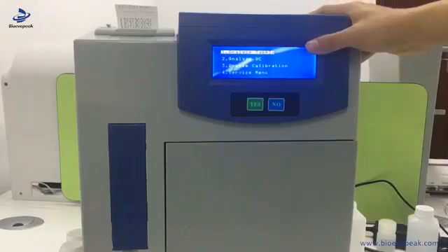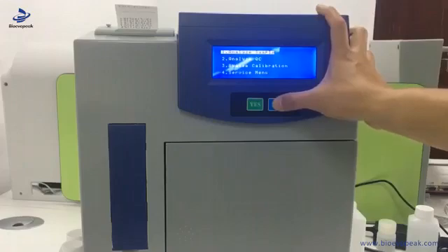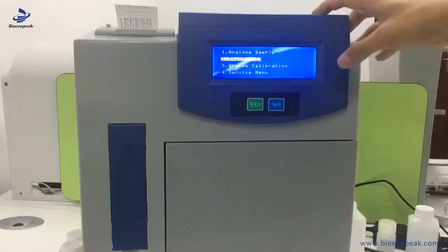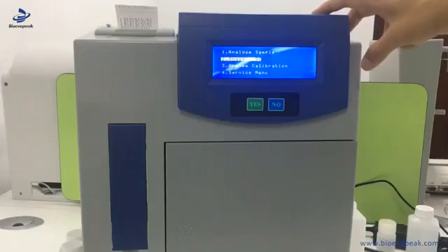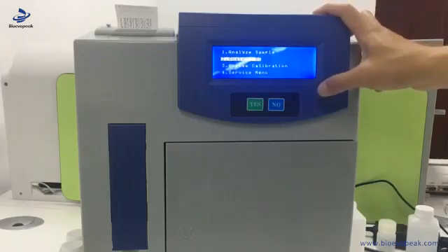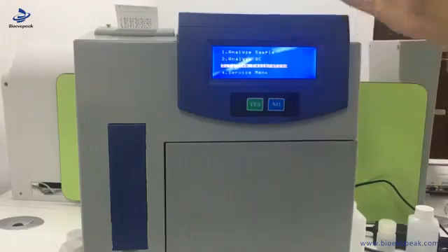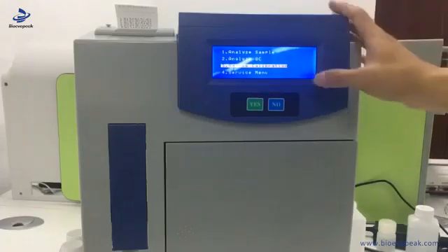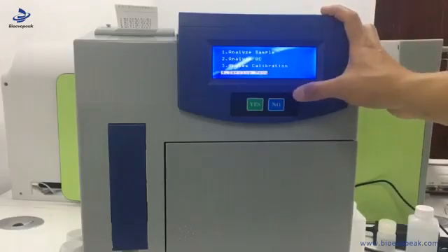Let's go to the first page. This is the sample analysis — it's the first one the end user uses most. The second option is analyze QC: when the end user feels the machine is not correct, we use the QC solution to check it. The third one is the service calibration — when the result is not stable or not right, we do the calibration to make the basis correct. If you need other services, we go to the fourth menu.